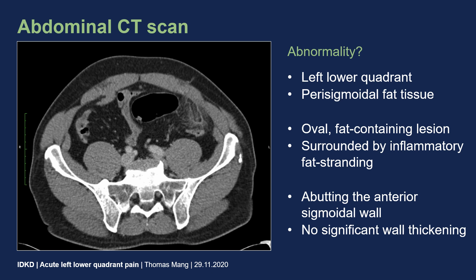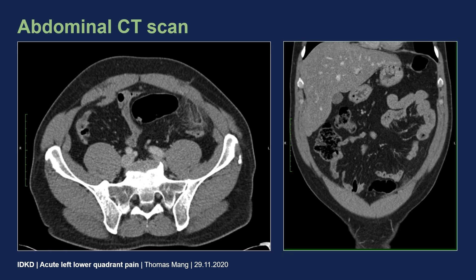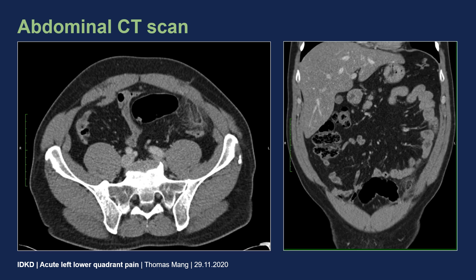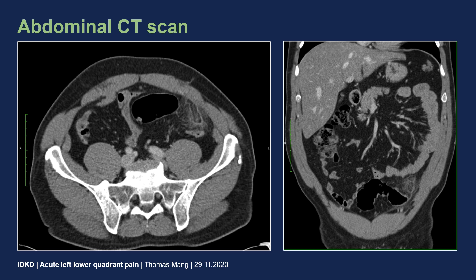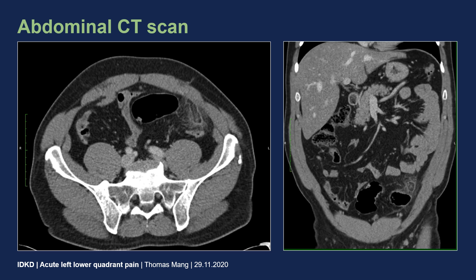It is abutting the anterior sigmoidal wall, but there is no significant associated wall thickening of the sigmoid colon. Here are also the coronal CT images showing the lesion in the left lower quadrant. The lesion is located within the perisigmoidal fat tissue, shows an oval shape, contains fat tissue, and is surrounded by inflammatory fat stranding.